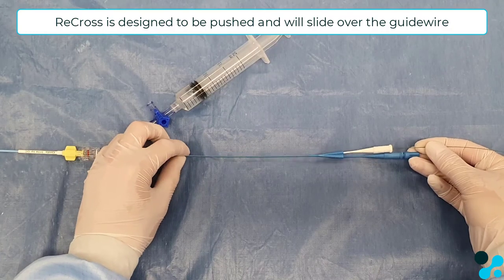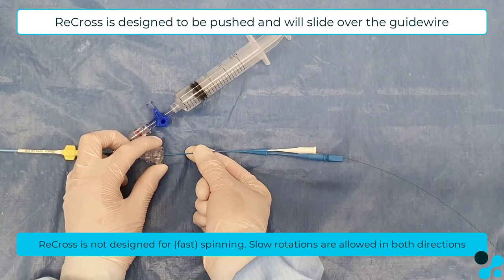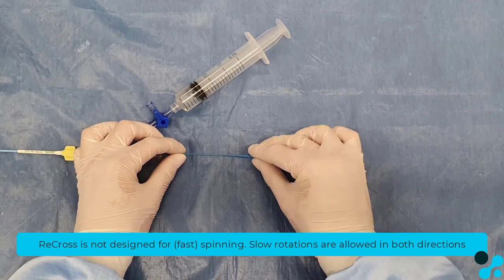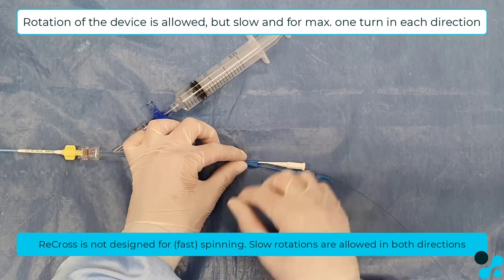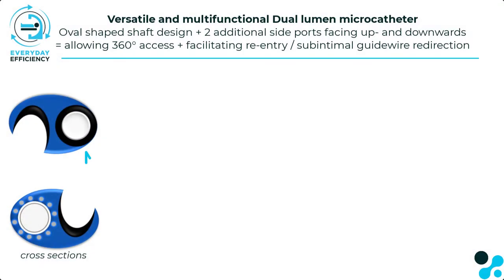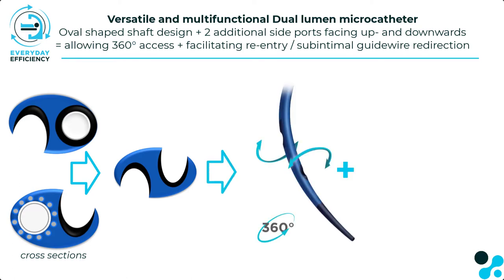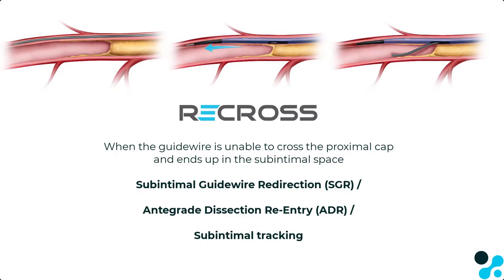Recross is a device that should be pushed over the guide wire, so it will slide over the guide wire. Its shape does not allow fast spinning — slow rotations are allowed in both directions, but if the torque tension is increased too much, it is important to stop because the forces will be too high. The Recross is versatile and multifunctional; the cross sections show that the shaft is ovally shaped and the exit ports are positioned facing up and down. This design facilitates the option for re-entry and redirection of guide wires.